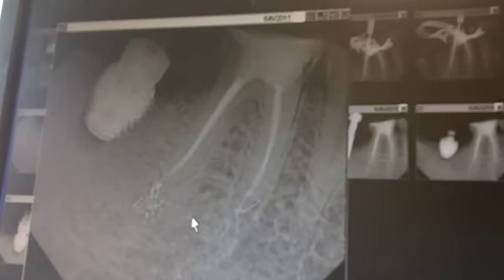Basically, the number of appointments was 3 appointments. He came in, got the tooth extracted, we placed some bone in the area, waited for it to heal up, and then the patient came back and we placed the implant, all using high-tech instruments and equipment, and we were able to see where his nerve was and go from there.